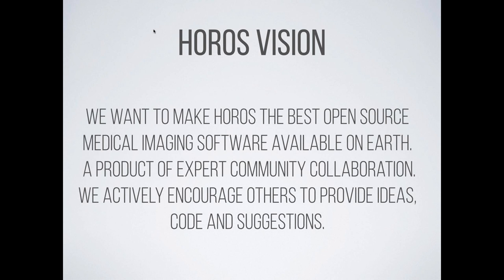and thoughtful. So our vision, we want to make Horos the best open source medical imaging software available on Earth, a product of expert community collaboration, and we actively encourage others to provide ideas, code, and suggestions. And that is a very succinct vision that we intend to take Horos forward with.